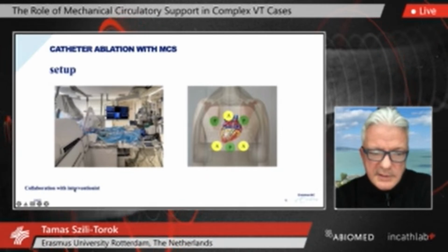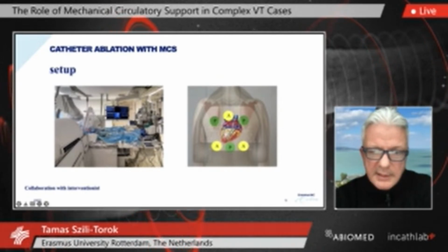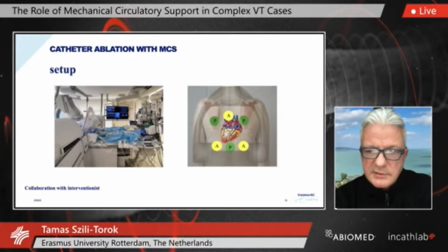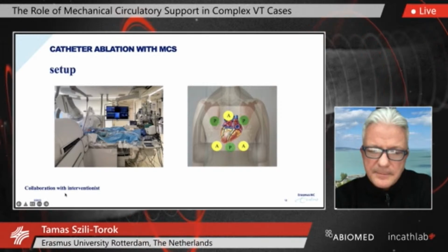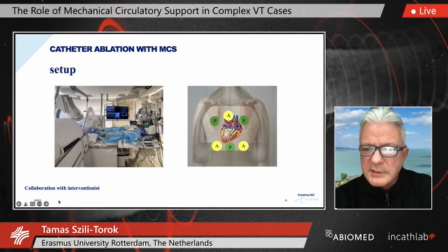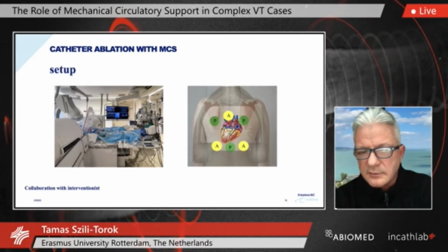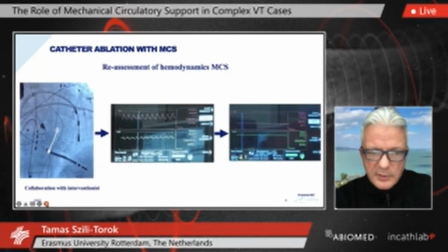Here, I wrote something downstairs, that collaboration with the interventionist. It is interesting in our lab, we always ask the interventional cardiologist to put the Impella device into the heart, and they also remove it and they do the closure. This is because they are very experienced in arterial access sites. I think it's a very wise method. It's not that we cannot puncture. For instance, I do most of my ablations still retrogradely. But I think for these big devices, those people can make the difference.